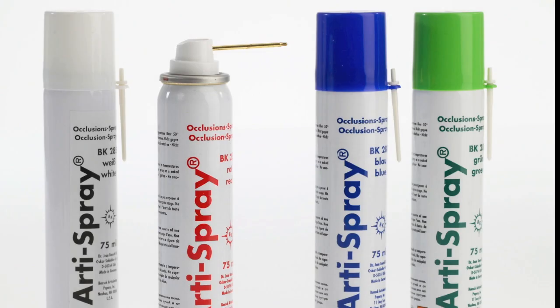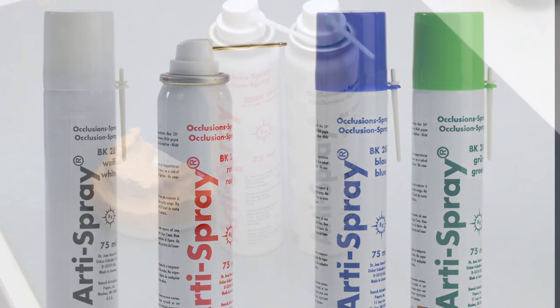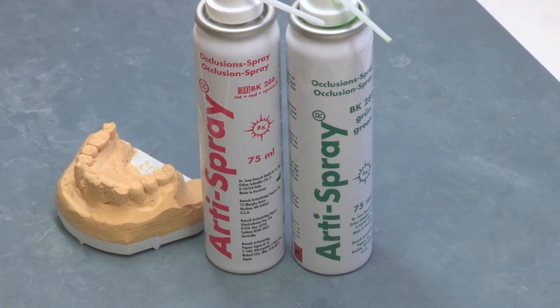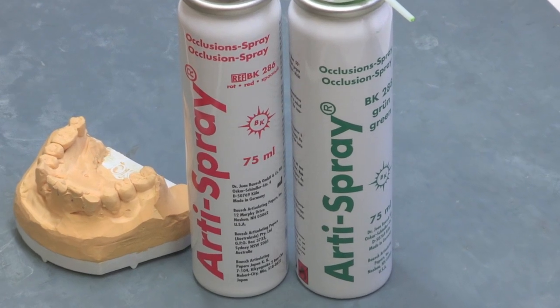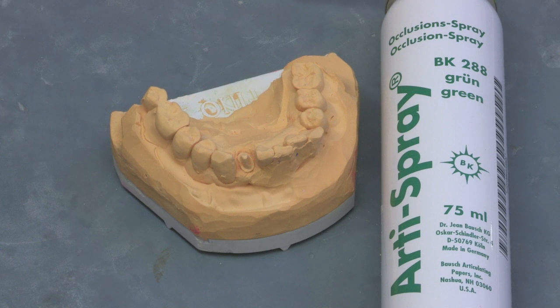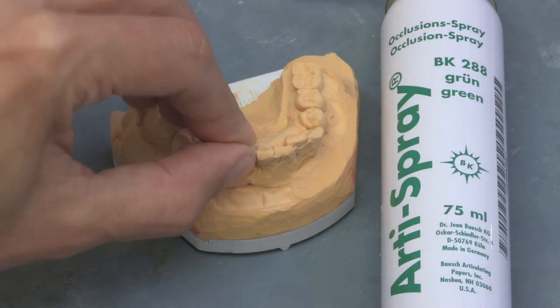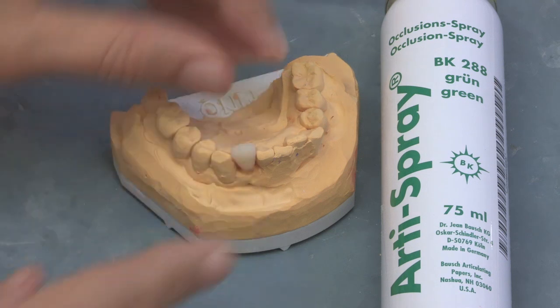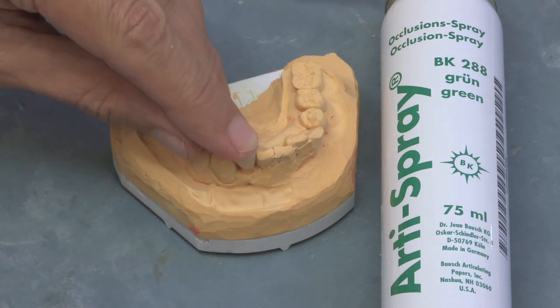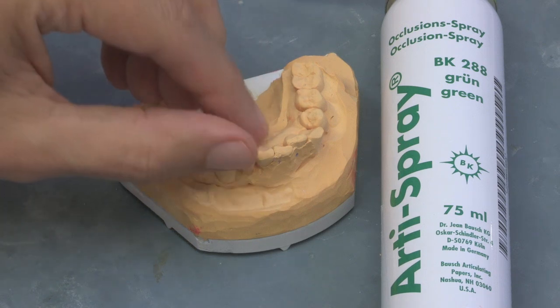Arti Spray is a universal color indicator to test the occlusal contacts and accuracy of fit of crowns and bridges. Arti Spray is easy to administer and leaves a thin colored film which can easily be removed with water, leaving no trace of residues.